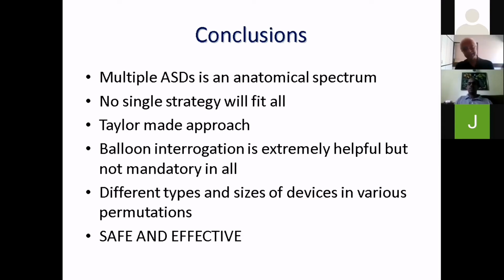And with our experience, we can say that transcatheter strategy is a safe and effective way of taking care of multiple ASDs. Thanks for your patient hearing, ladies and gentlemen.